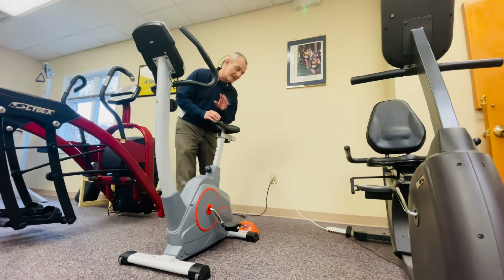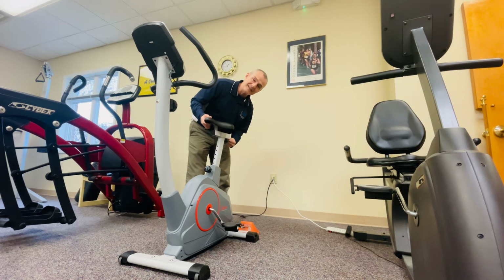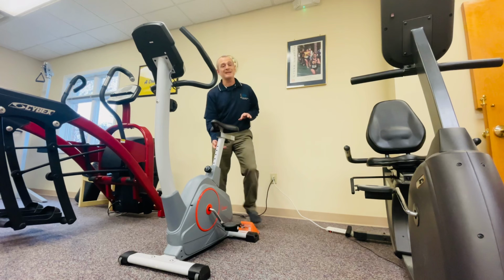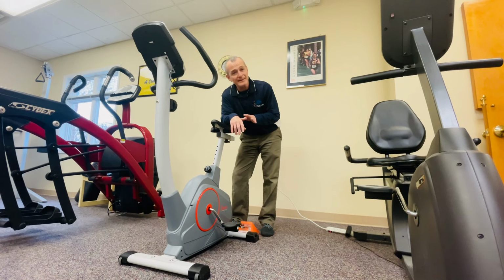But something I do like about the seat is there's an adjustment back here that allows me to slide the seat forward or slide the seat back. And when you're attempting to increase range of motion through your knee after a total knee replacement, being able to position yourself either over the pedals a little more, behind the pedals a little more is really helpful.